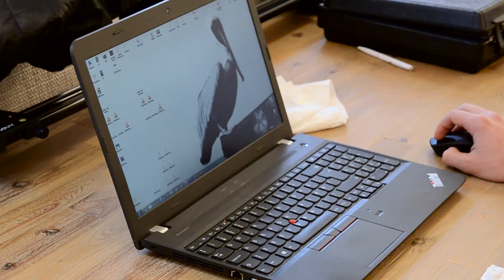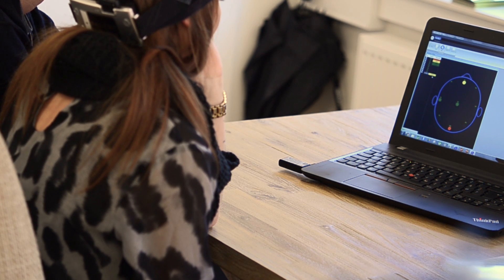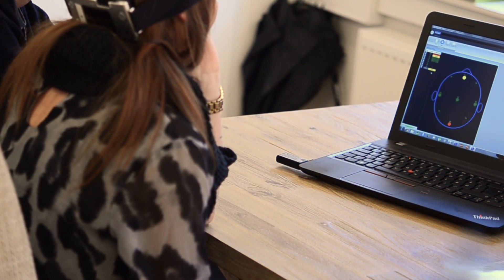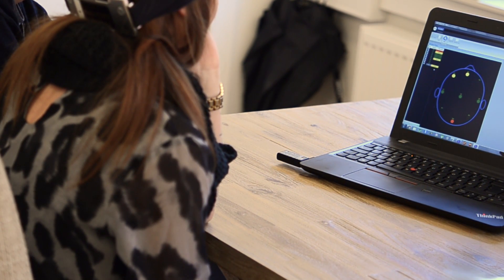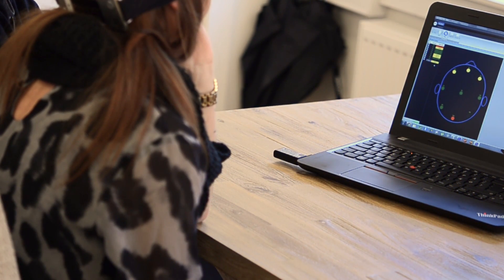In the end process of setting up the EEG, we have to make sure that all the passive electrodes are attached properly so that we can get the correct results. This is done by running the impedance test on our computer, which shows us how well each electrode is connected.